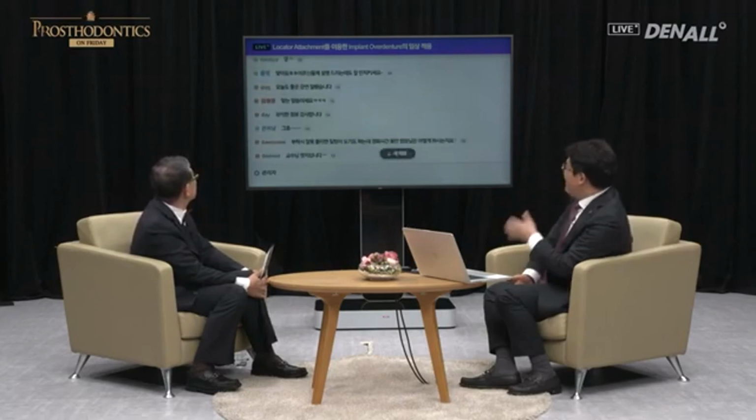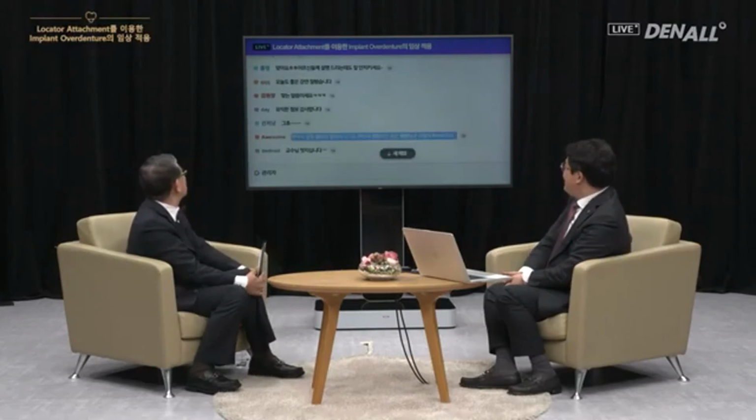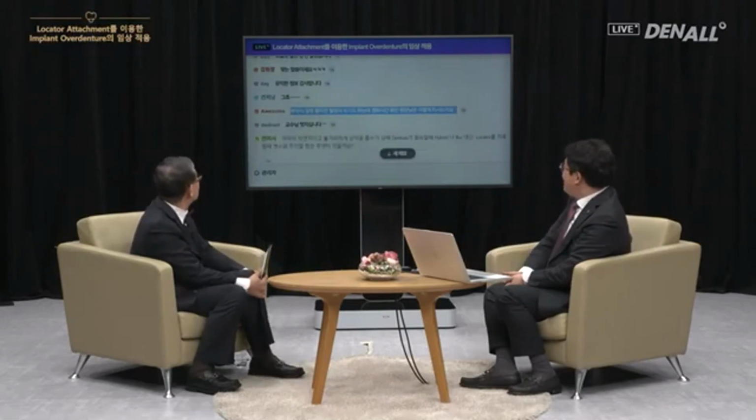Yes, older patients don't really listen. Awesome. As we attach the prosthesis, if the patient bites wrong, tilting occurs. What do you do during the hardening period?